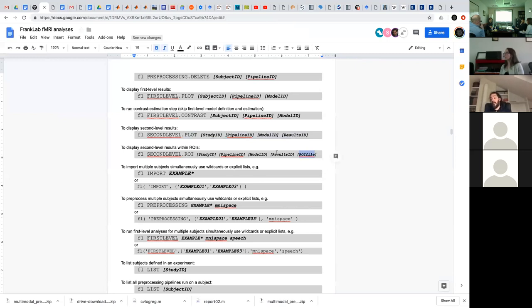So yes, for those types of cases where you want to do manual edits for individual subjects, or when you want to do actual manual definitions of the ROIs for individual subjects, is where you might want to have this type of functionality to have subject-specific ROIs. But in most common scenarios, you would use the typical single ROI across all subjects framework, which is what we have right now. In most scenarios in this lab, though, we do the individual. Yeah, I would say in most.